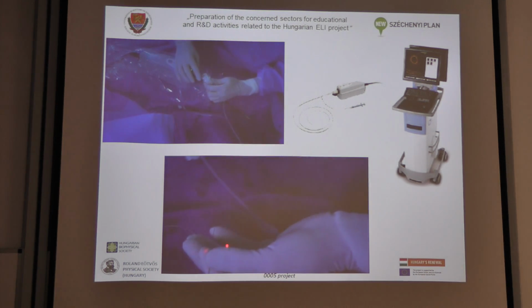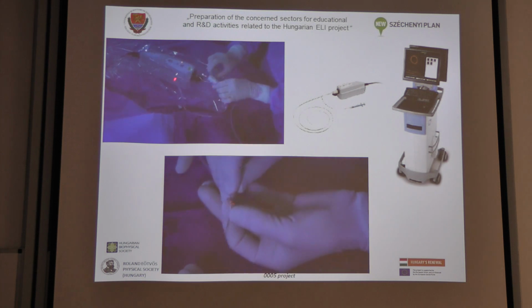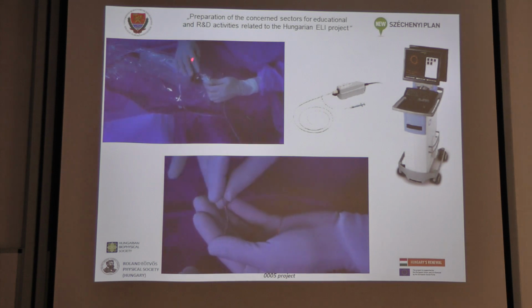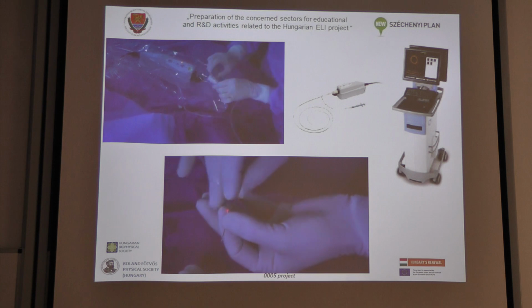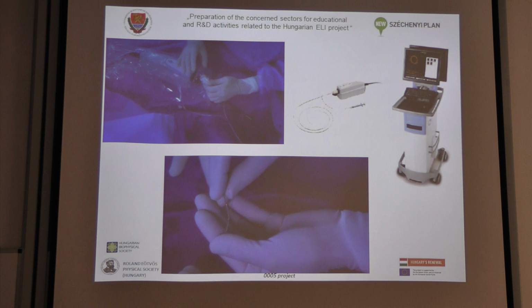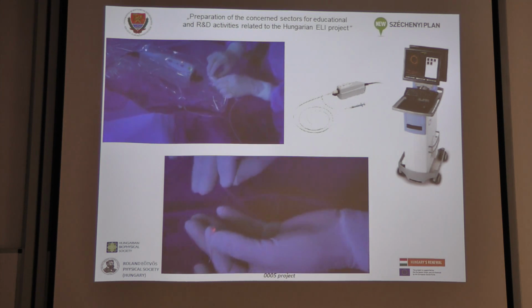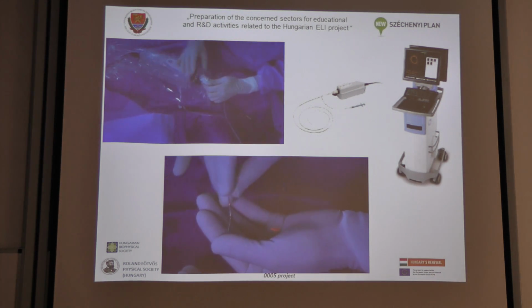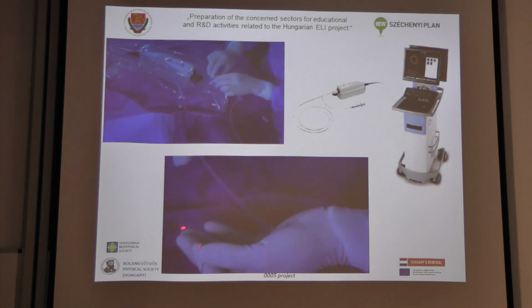And for the OCT, this is of course the same. And this is how we connect it to the motor drive unit, which will spin this optical cable with a very large rotation speed. This is around, I really don't know it by heart, around 2,000 rotations per minute, the spinning rate.